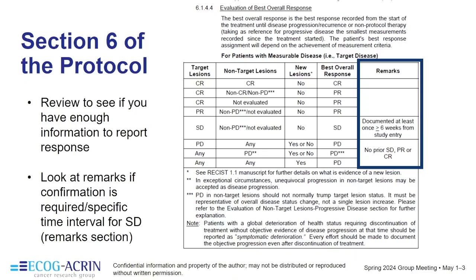However, there is a specific time interval to report stable disease. This is common throughout all RECIST studies, so please make sure you're checking that the time interval for stable disease has been met in order to report it.